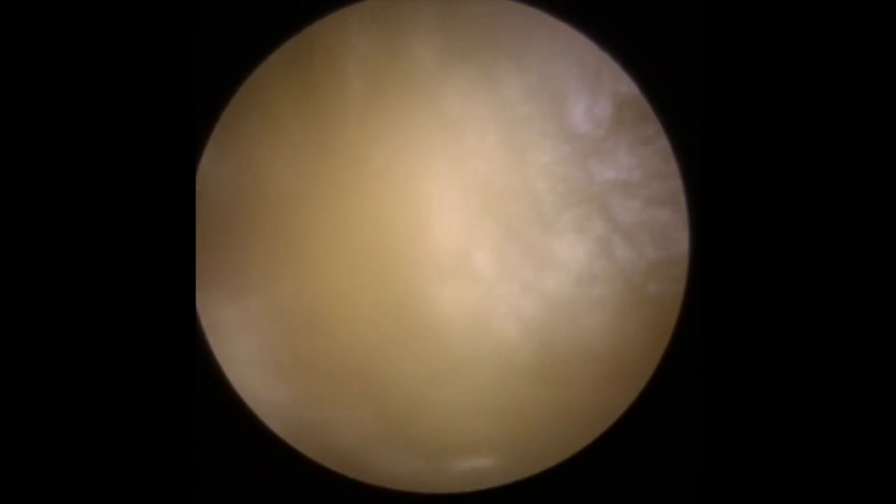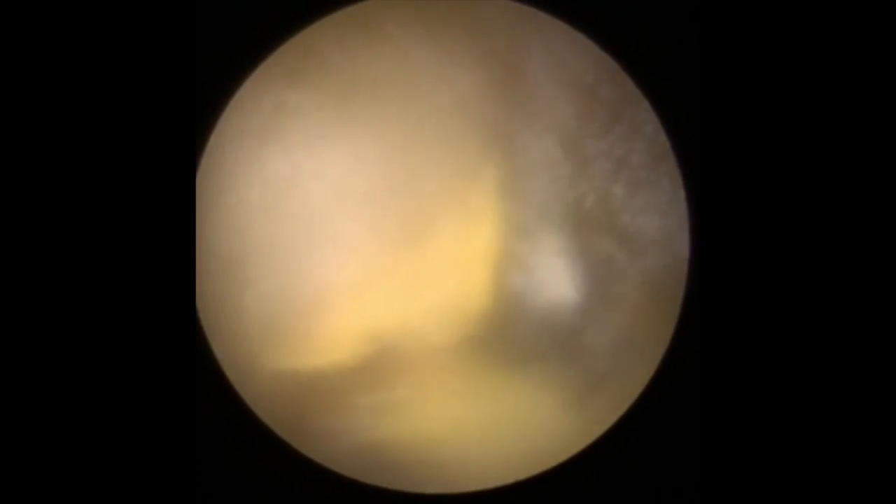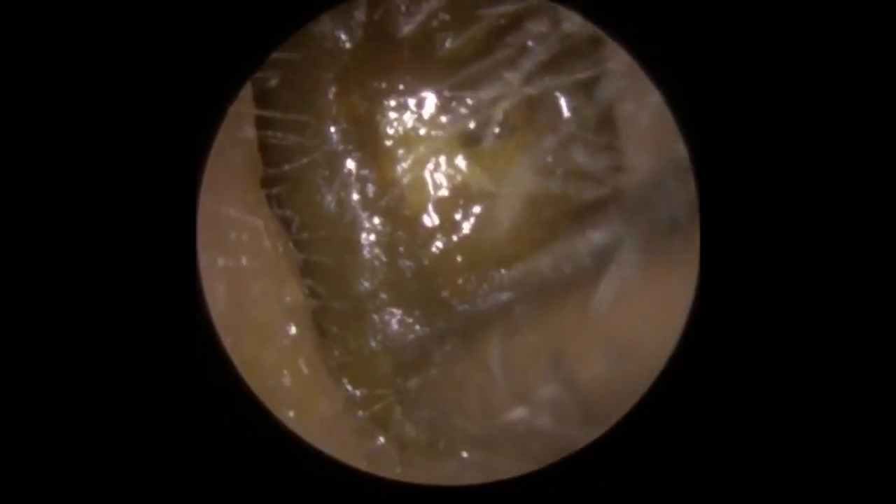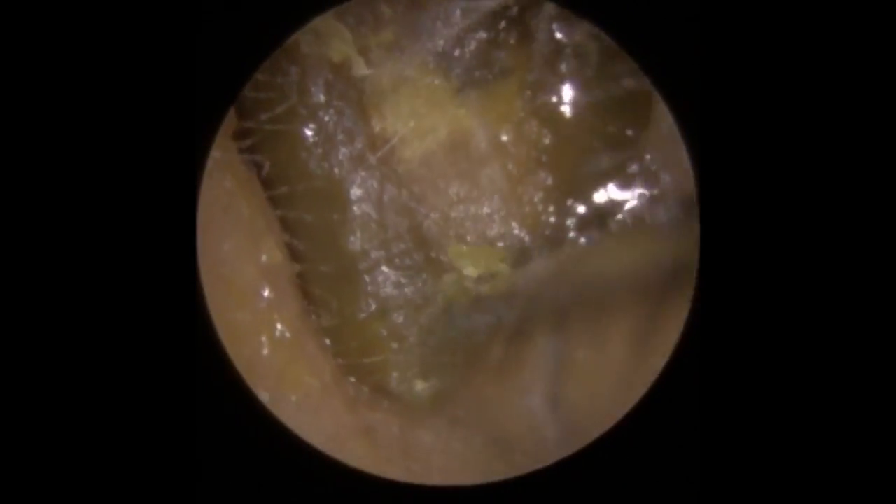What you can see here, this looks at first glance to be a much softer wax on this side — same patient with the other ear. But what we've got is just a lighter coloured wax, basically, but still hard as a pebble. You can see when you're passing the suction tube over it, even with the olive oil we've sprayed in there, we can't get a good enough grip. So I'm going to go back to the Jobson horn for this side as well.